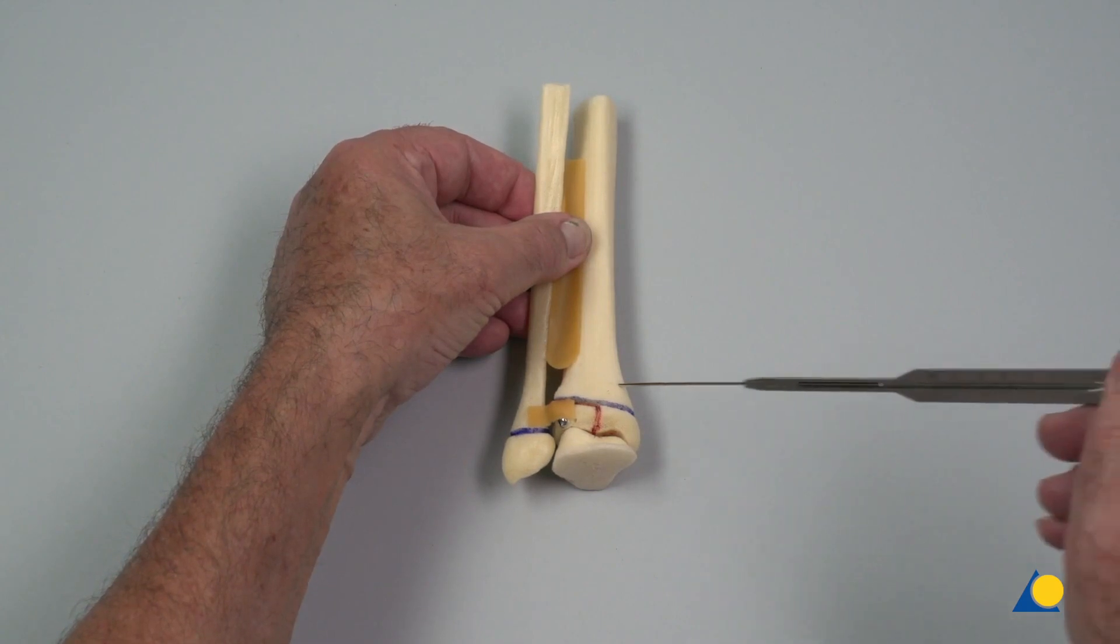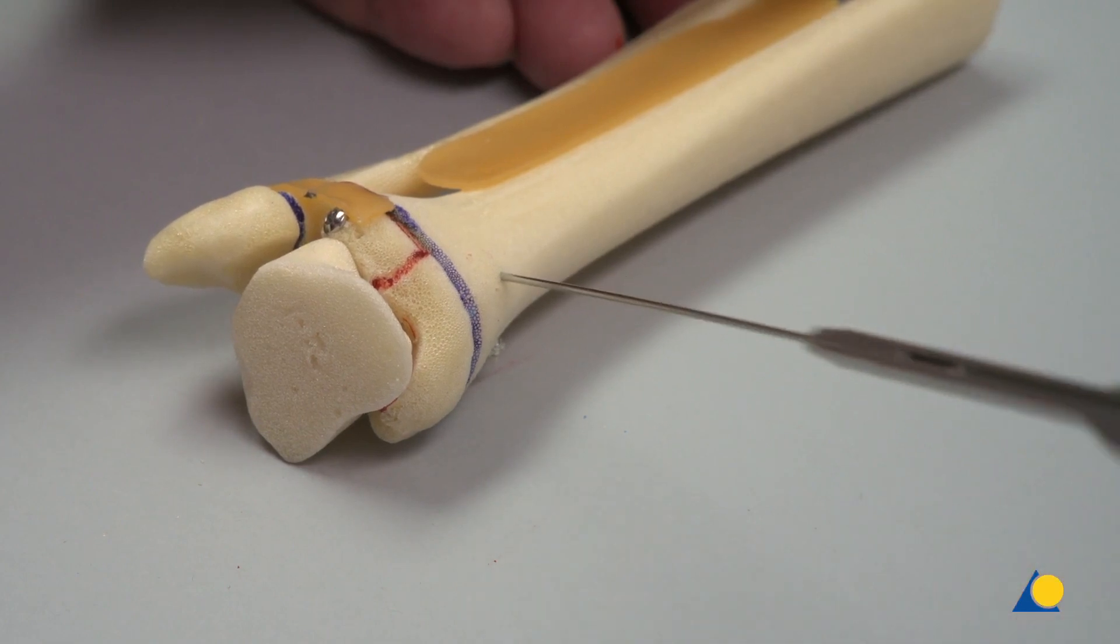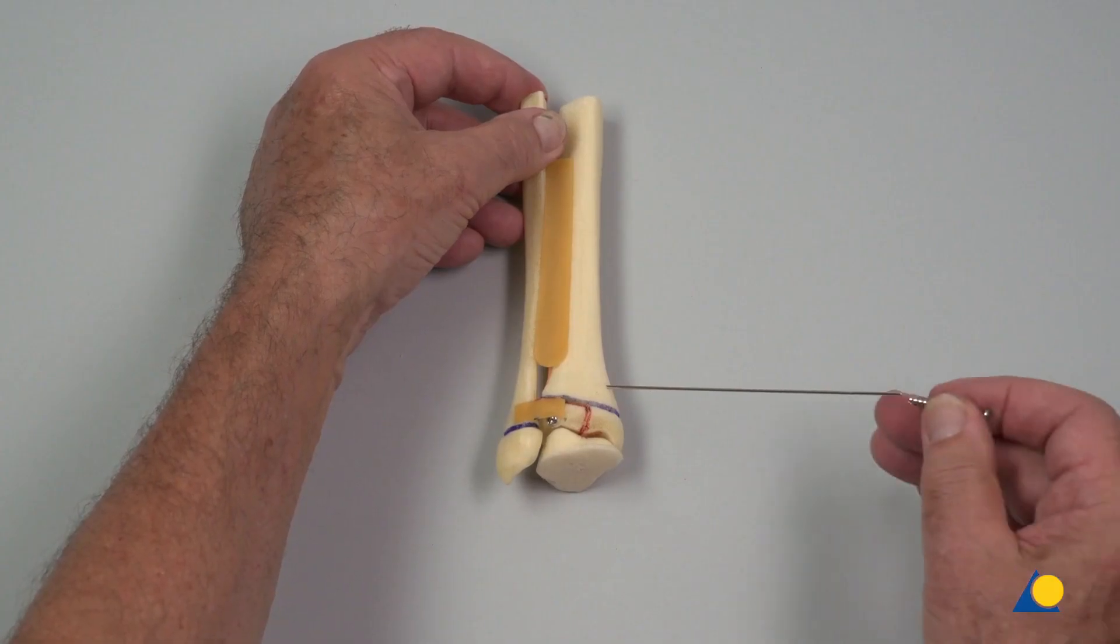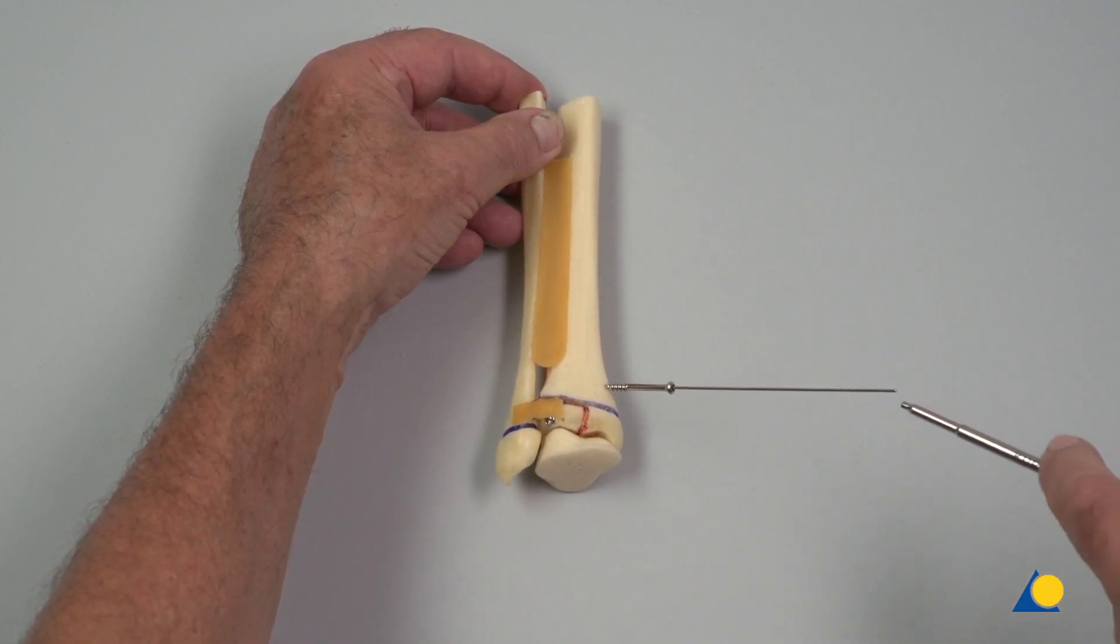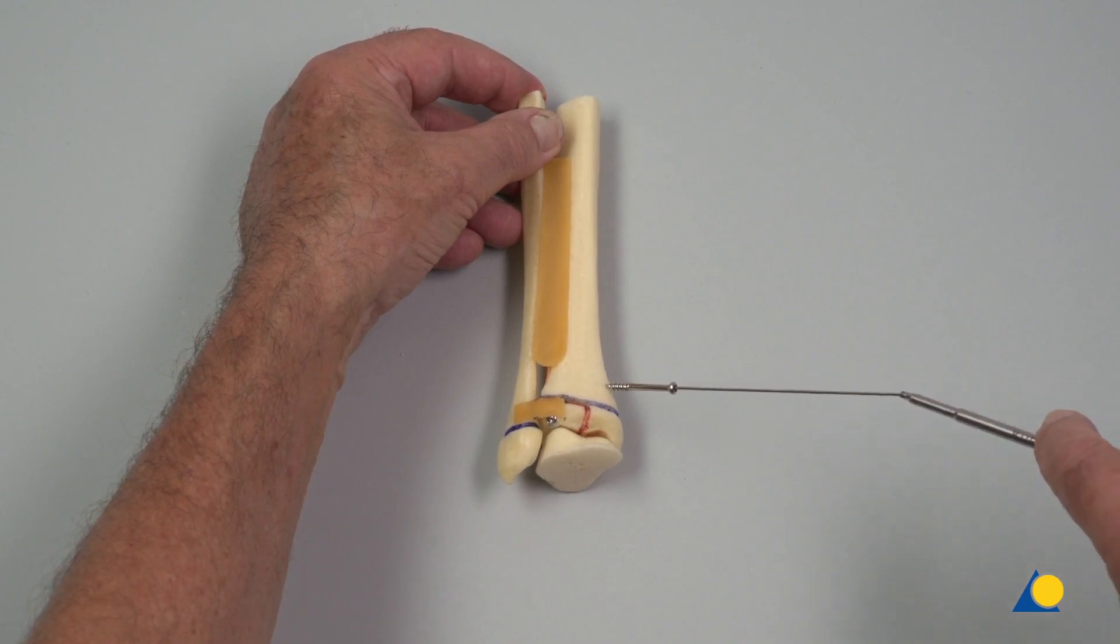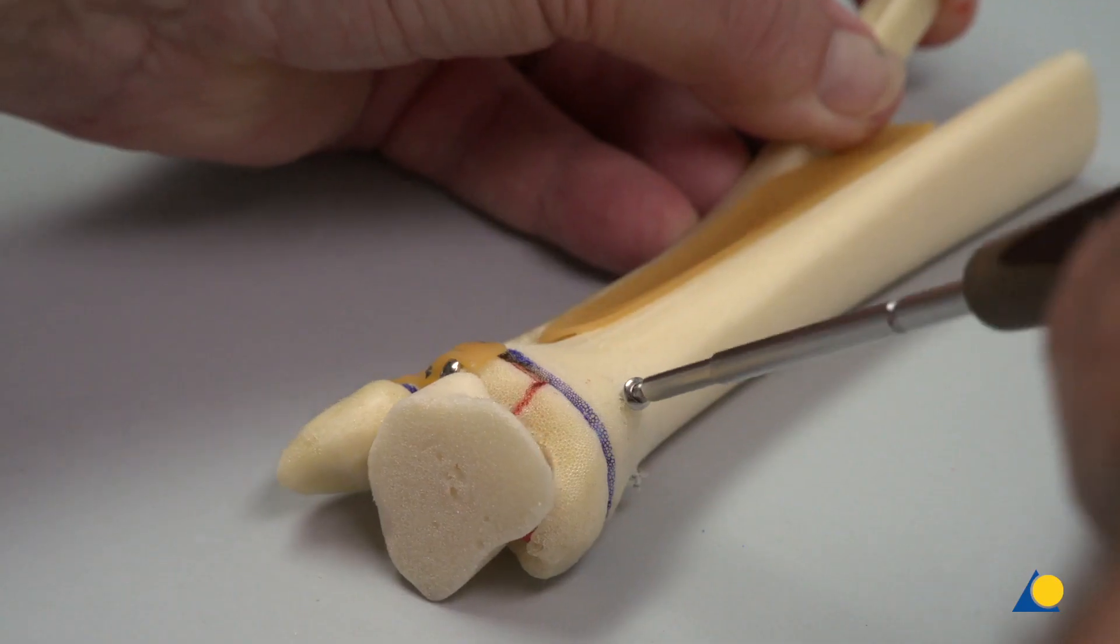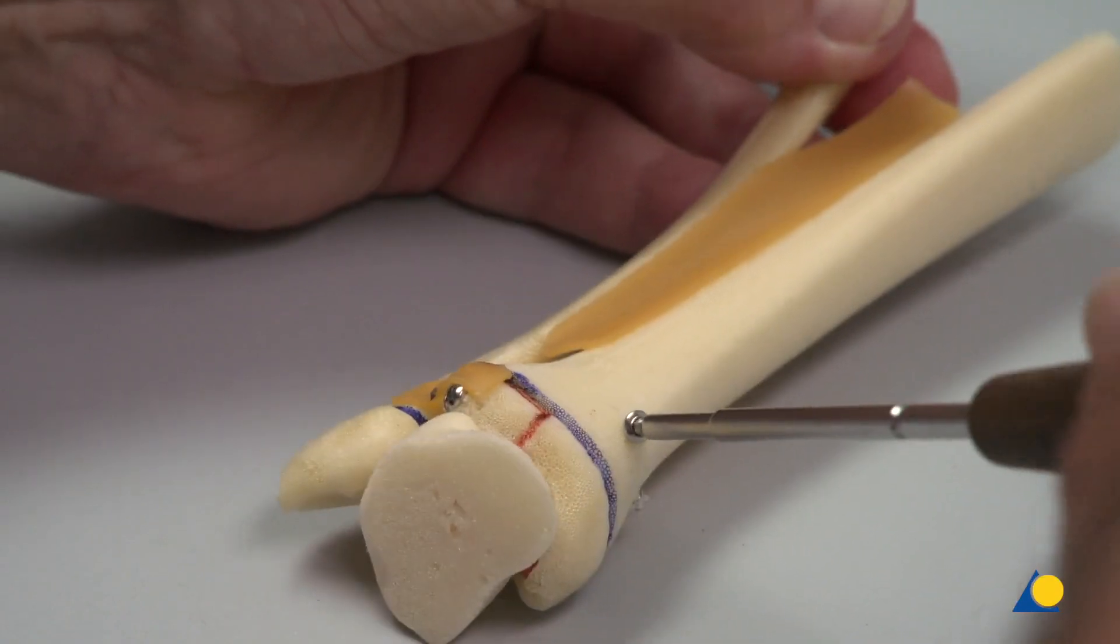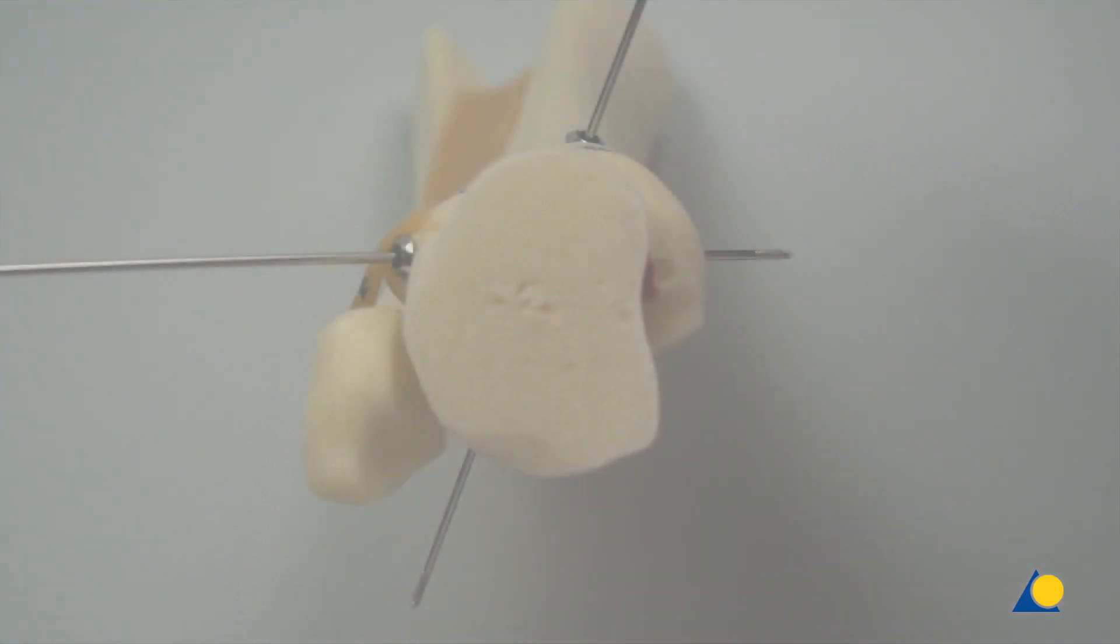The screw length is measured using the depth gauge. The cannulated screw is slid over the guide wire and inserted using the screwdriver. In the axial view, the nearly perpendicular position of the two screws is visible. The posterior metaphysial fracture is reduced and fixed.